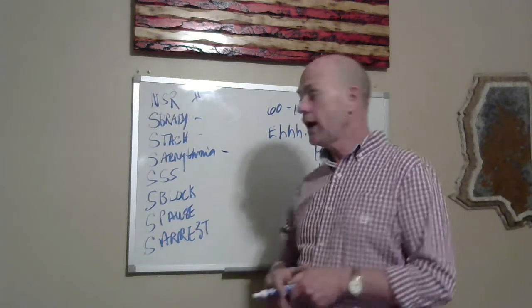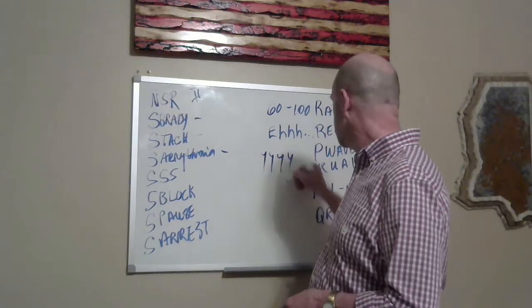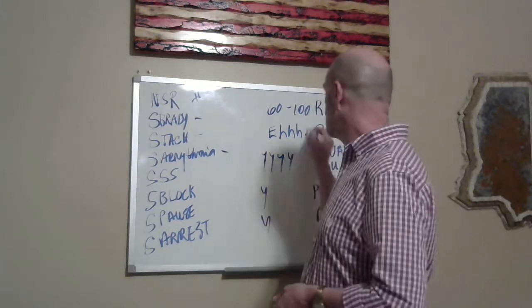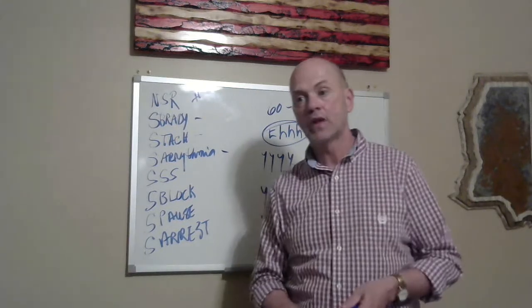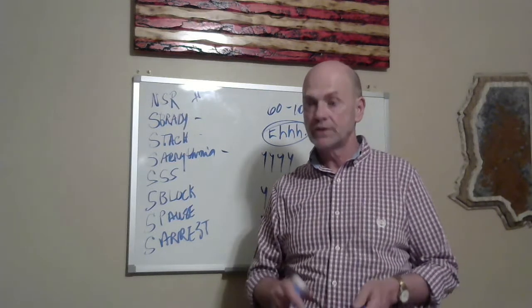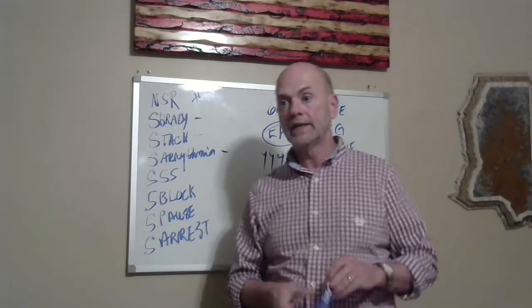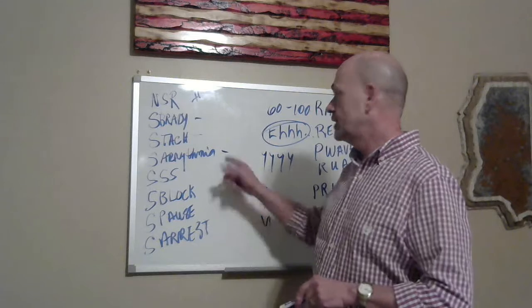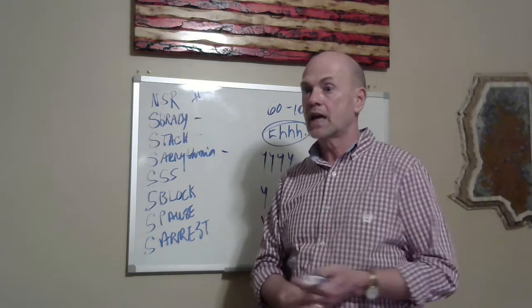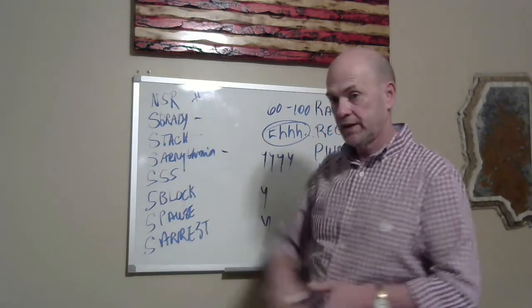If they were absolutely regular, and all these others are answered with yeses, it would be a normal sinus rhythm. It's not a normal sinus rhythm because right here it is slightly irregular. And if you glance at it, you may not even see the irregularity, it is so slight, sometimes associated with just the inhalation, exhalation, the ventilatory exchange. So sinus arrhythmia, what do we have to do to fix it? Absolutely nothing. We don't fix sinus arrhythmia. We don't fix sinus tach. We might fix sinus brady, and we don't fix normal sinus rhythm.